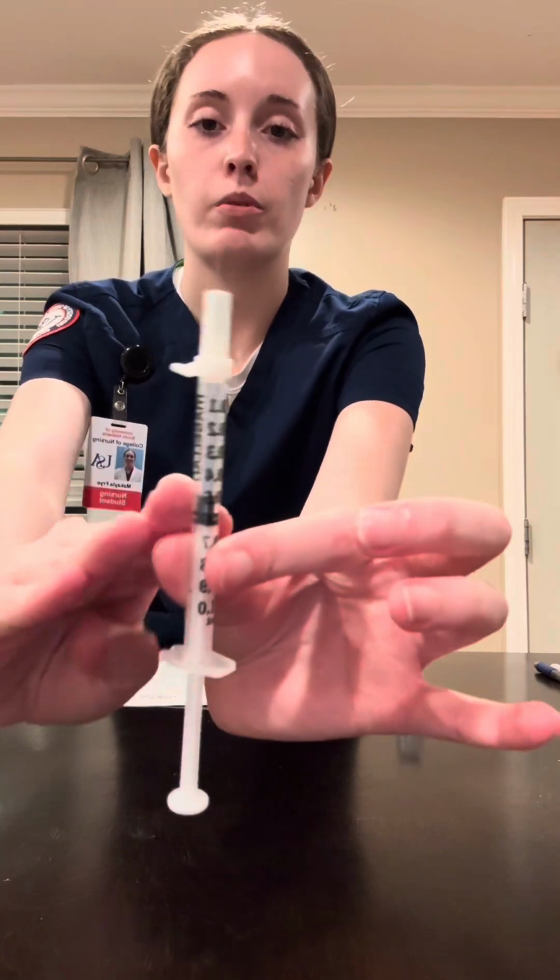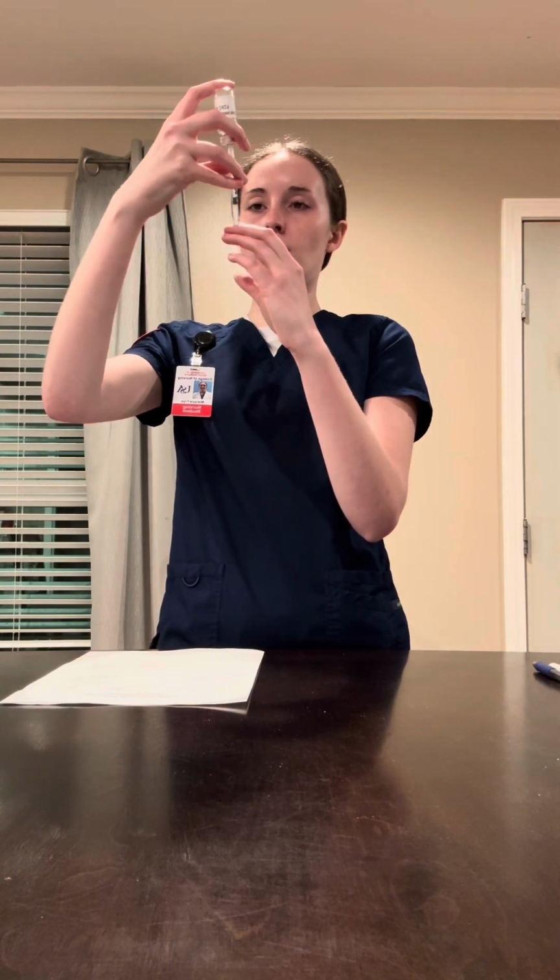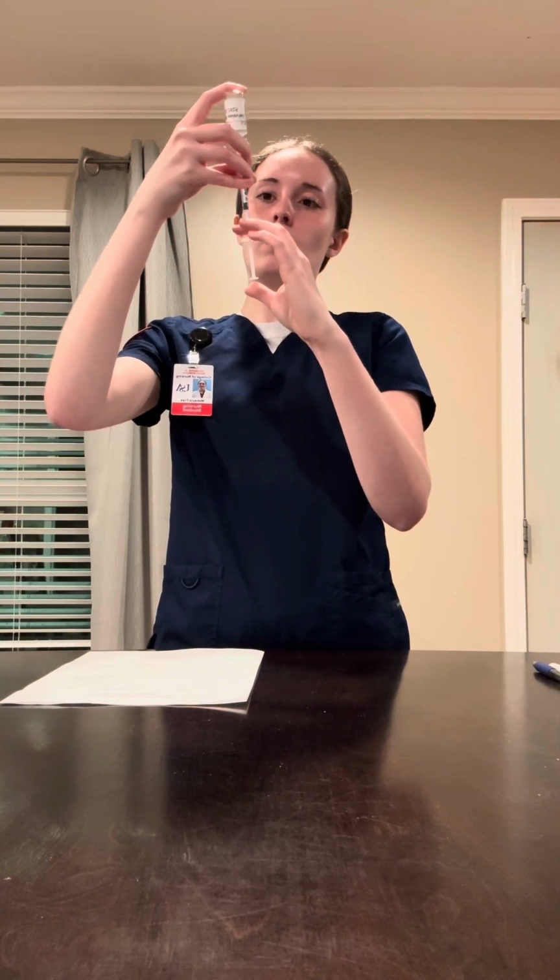Okay, so here is the 0.5 milliliters of air. Okay, perfect. So now I'm going to place this in here. Steady it. Okay, push the air in, and let it fall back. And I'm going to draw up 0.5 milliliters. Get all the air bubbles out.